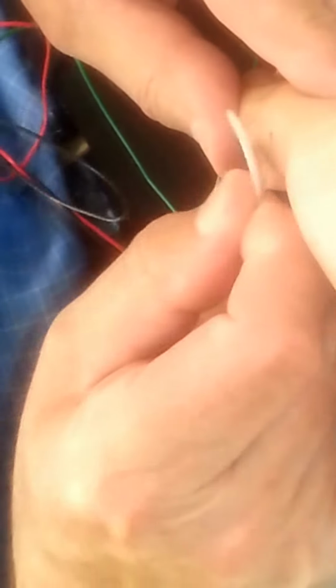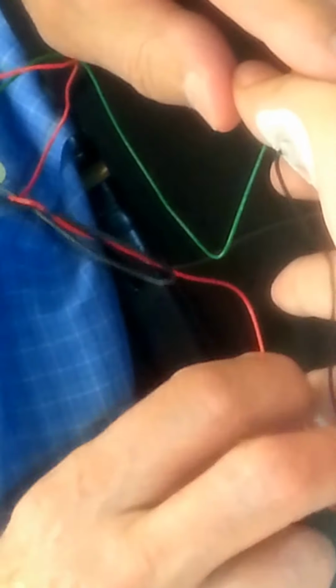Now we're going to do 2 different nerves to the thumb. One through the carpal tunnel and one through the radial nerve. Okay, so this is the carpal tunnel nerve, or the median nerve. This one can hide under a tendon. Let's try over there. There, we got it. 2.9. Again, very, very fast. Let's have you roll your wrist over that away. Now we'll send it down.